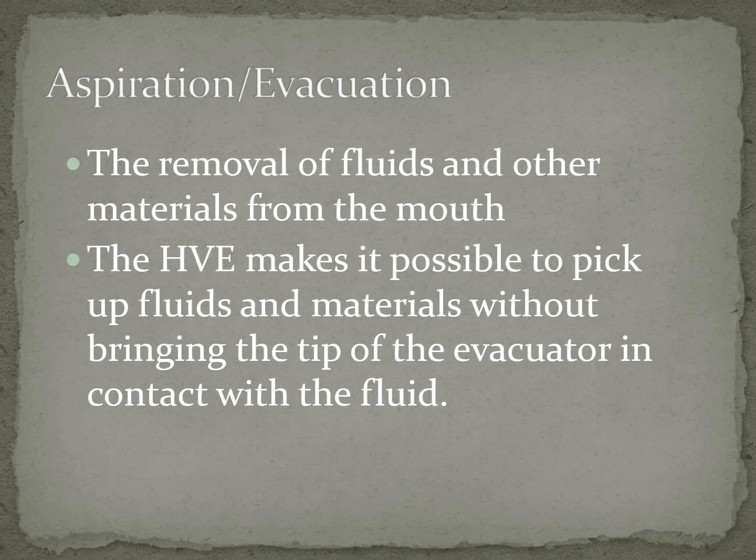Okay, now aspiration and evacuation. So this is like the high vac and our saliva ejector. So this is what's going to remove the fluid and other materials from the mouth.